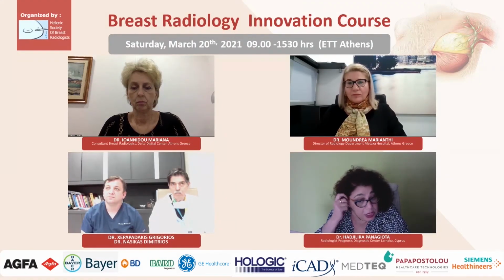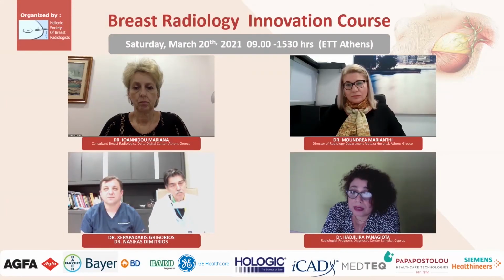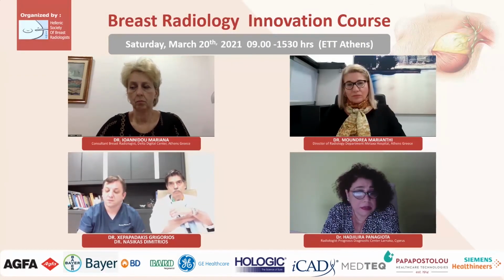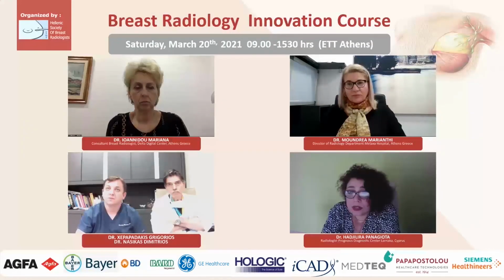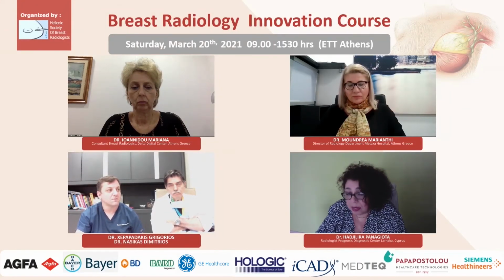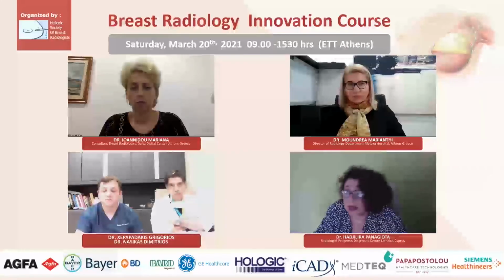The most significant challenge of contrast-enhanced mammography relates to the administration of contrast material, but for most radiologists who work in a multi-service radiology center like me or a hospital, this is familiar territory. I think we can overcome this. And it is very interesting and promising that some vendors are now offering contrast-enhanced mammography biopsy, since MRI-guided biopsy remains relatively difficult, and it's also very expensive.